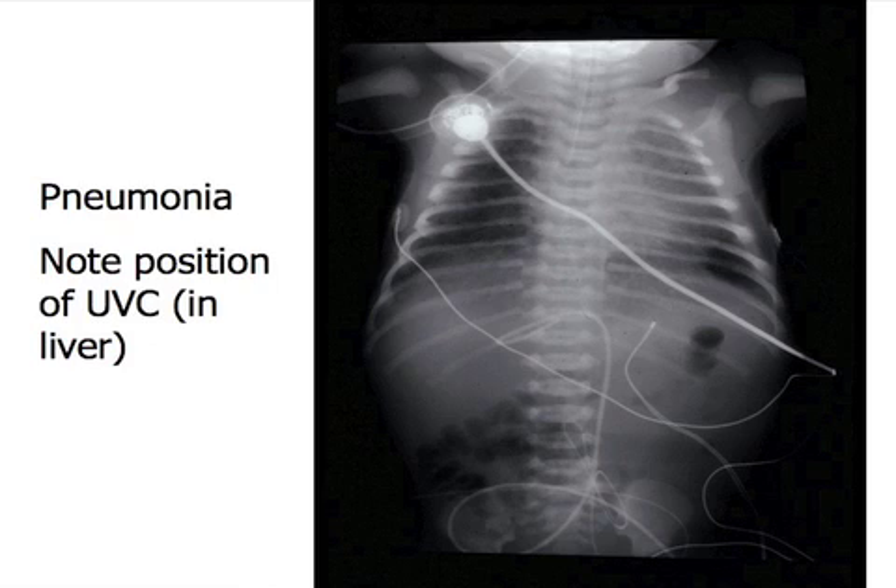See, it goes in right here. This is a loop on the outside. This is the insertion socket. It goes straight up, but it goes into the liver and stops there.